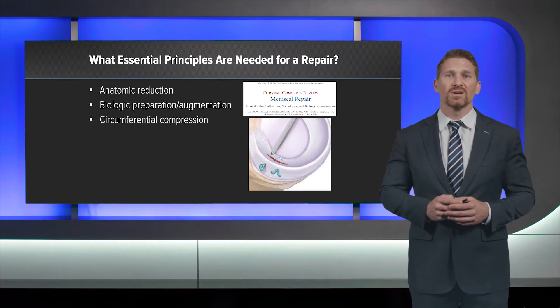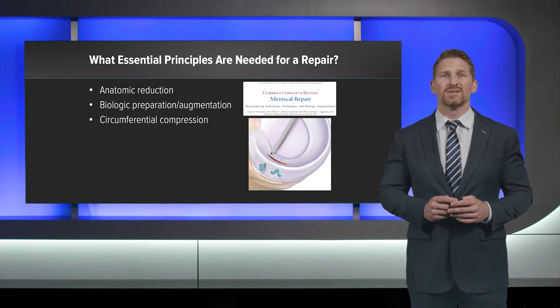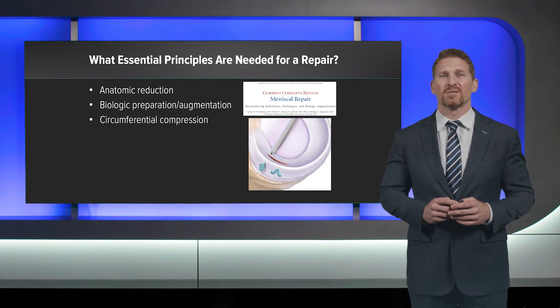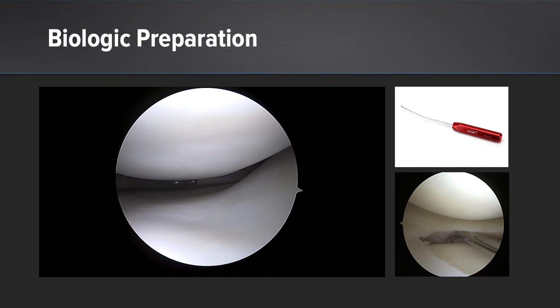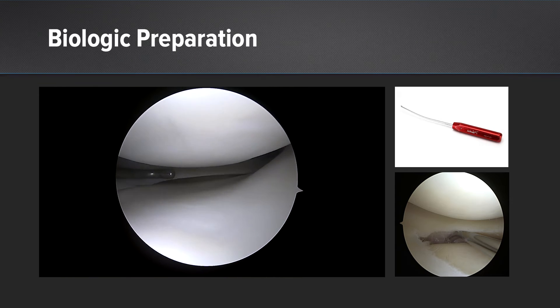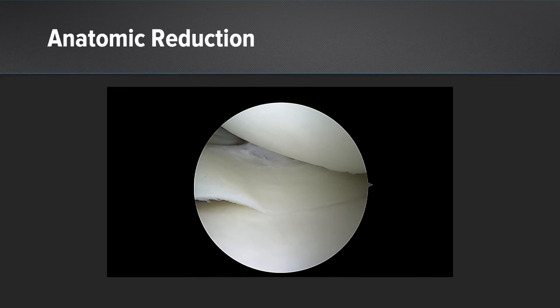When we look at the repair device, we can't forget the essential principles — what we call the ABCs of meniscus repair: anatomic reduction, biologic preparation, as well as circumferential compression. For this tear, we'll first perform biologic preparation. Sometimes we're able to use a shaver, but a lot of times we really like the Arthrex RASP — we can get in the tear site, abrade the synovium, and even get the back of the tibia to really deliver cells to healing at the site.